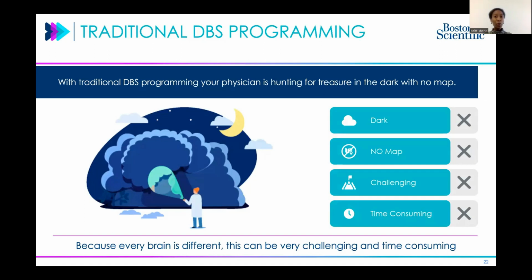But everyone's brain is a little bit different. We have atlases that give us an idea of what structures are where, but we are all individualized humans. So it can be a bit of a journey to make sure that, accounting for where the lead is and how someone's brain structures might be a little bit different, we're in the right place. And as you can see, it was dark with no map before image guiding.